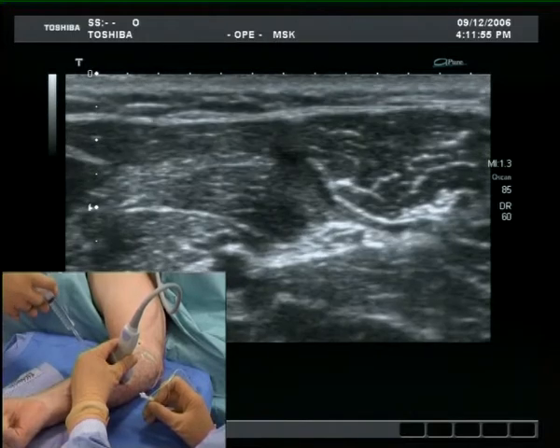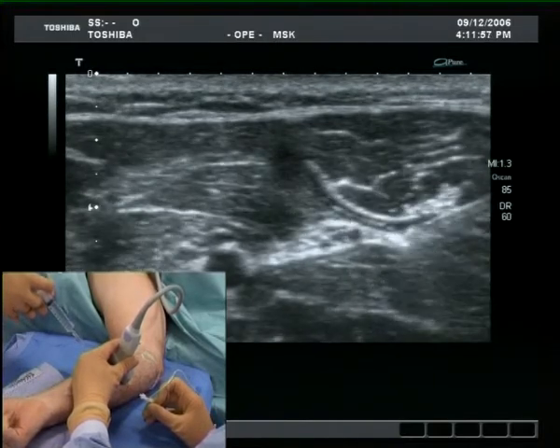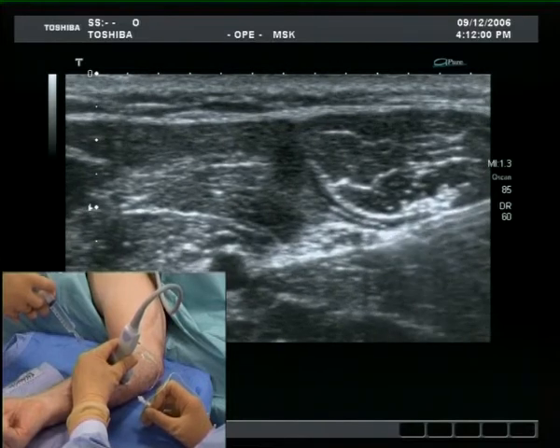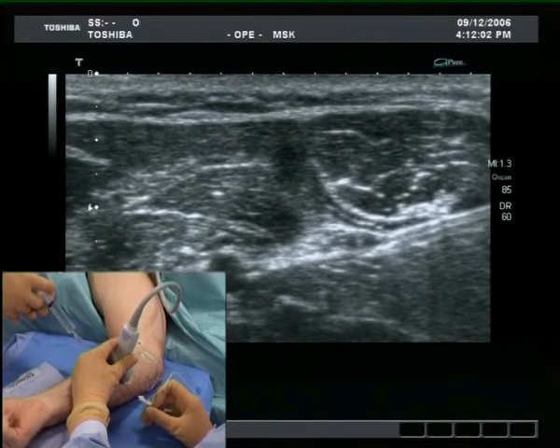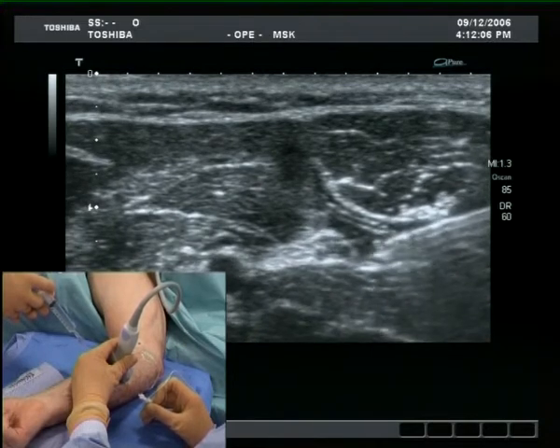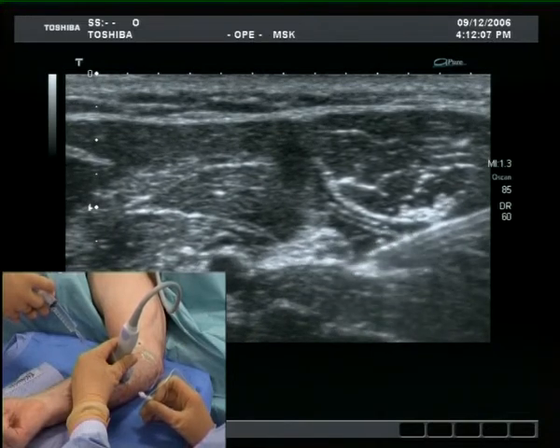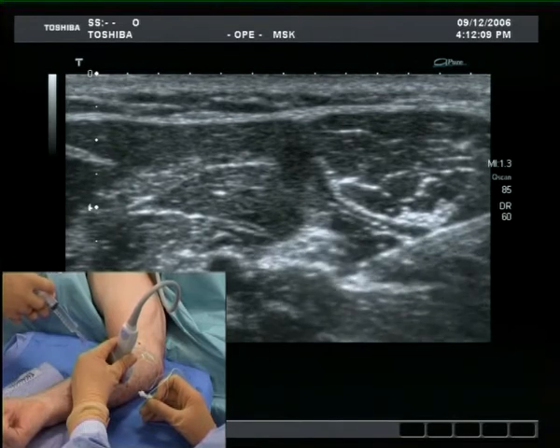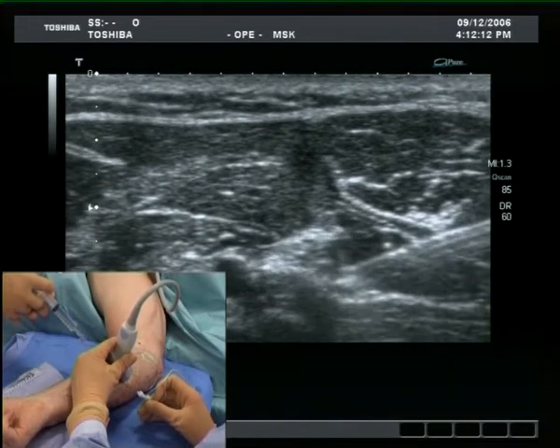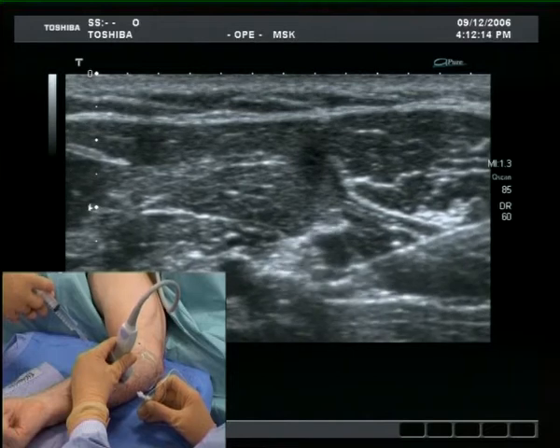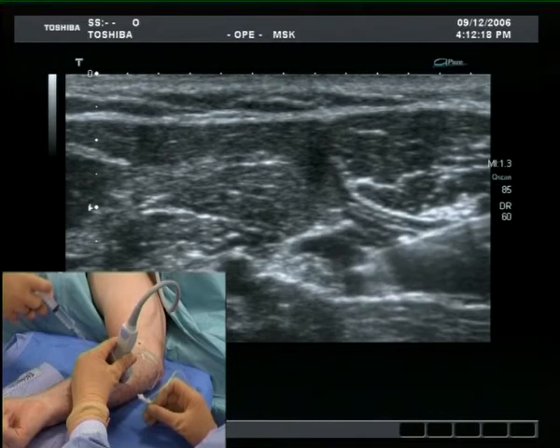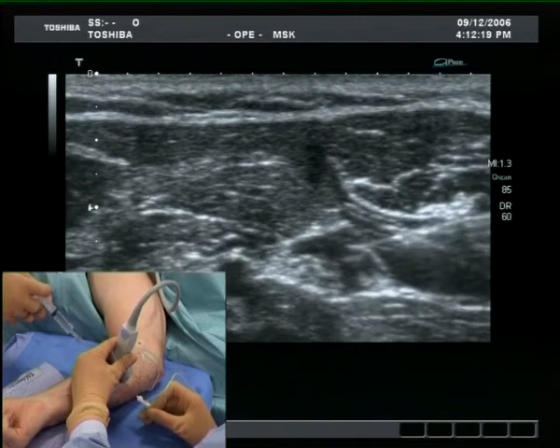Injecting just a quarter of a millilitre allows assessment of needle position and spread of the local anaesthetic. Note the spread over the medial and anterior aspect of the ulnar nerve. Moving the needle within the space generated by the local anaesthetic is easy and safe. Slow, small and controlled movements of the needle tip allow the nerve to be surrounded by local anaesthetic.